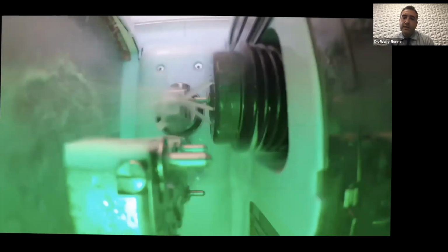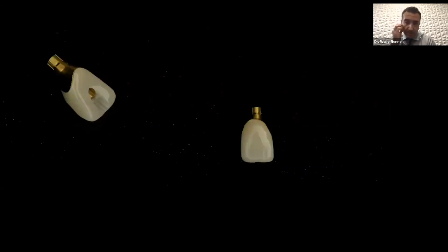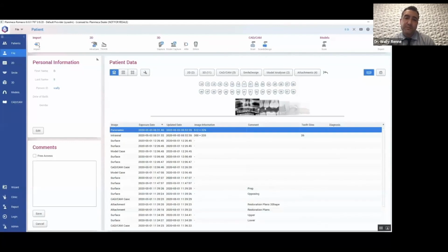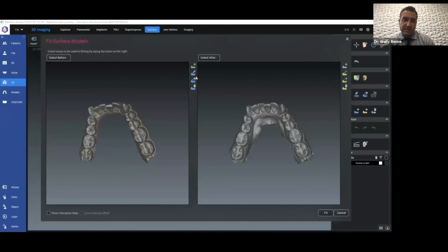All you do is if you have a chairside mill, you could mill that restoration and make a screw-retained restoration on a custom titanium, in this case gold anodized, abutment. And the all-in cost for that is like $200, versus, you could imagine, a custom abutment and crown from some labs is up to $700, depends.